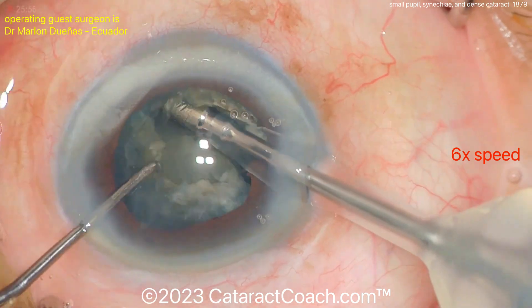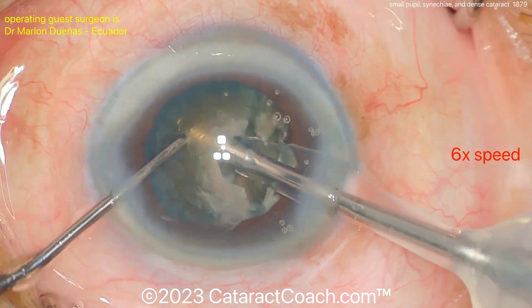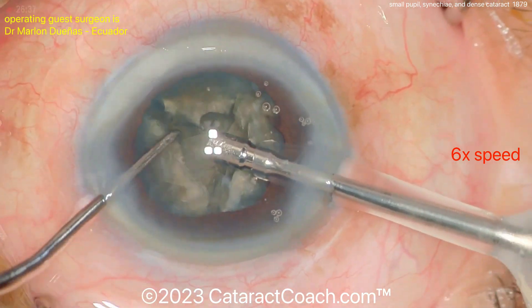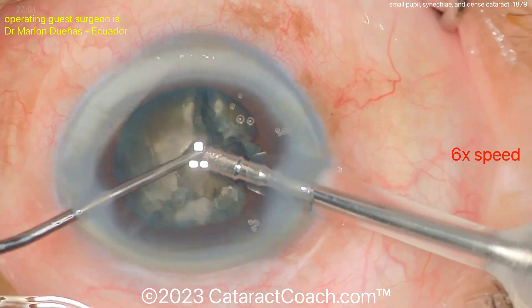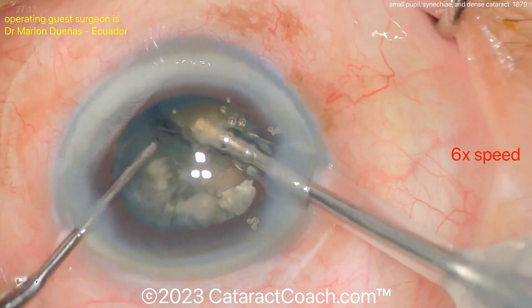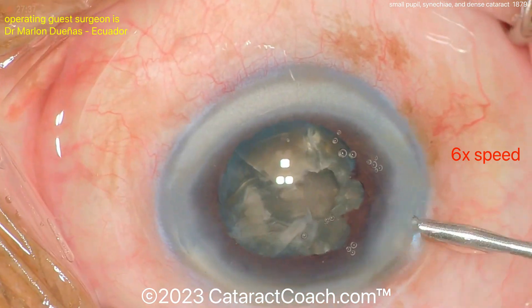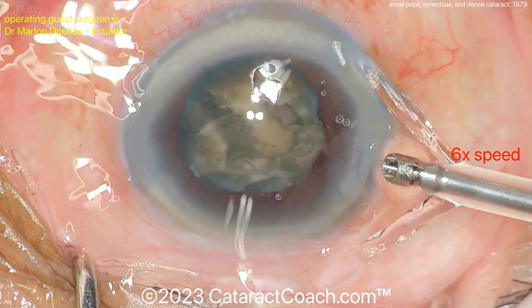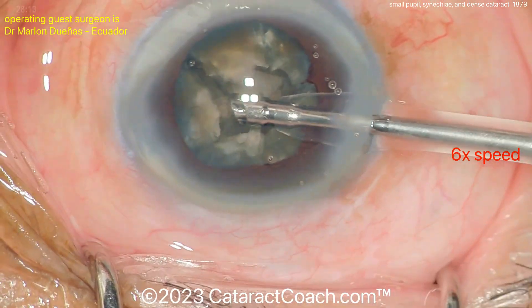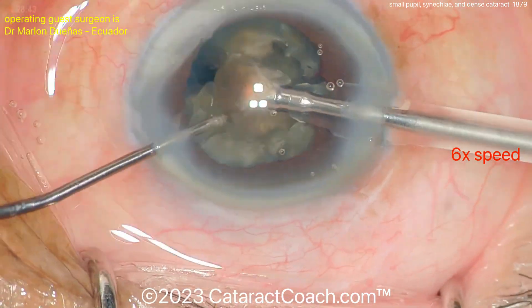You can use the YouTube controls to slow the video down if you wish, but this part is relatively routine. The key highlights of this case were: management of the synechiae and small pupil — breaking the synechiae gently, protecting the capsule, stretching the pupil in different meridians, and using micro scissors for sphincterotomies. Also coating the endothelium with viscoelastic — a very smart move.